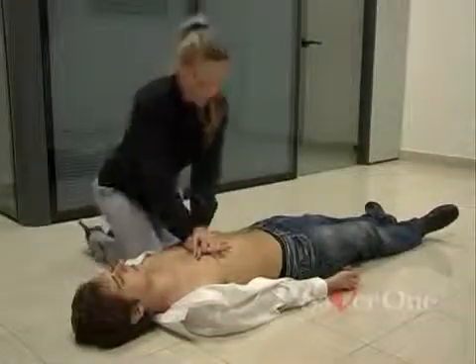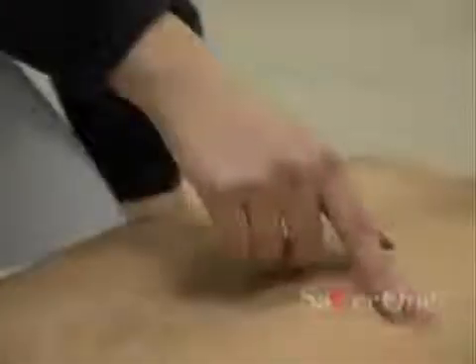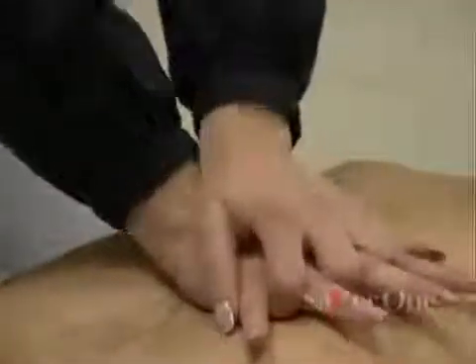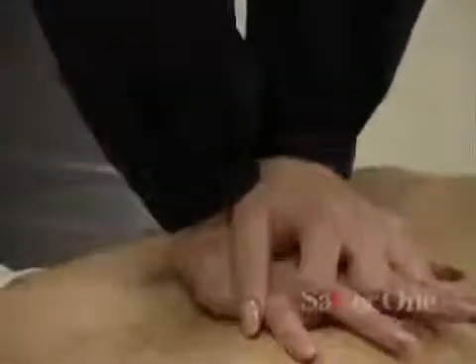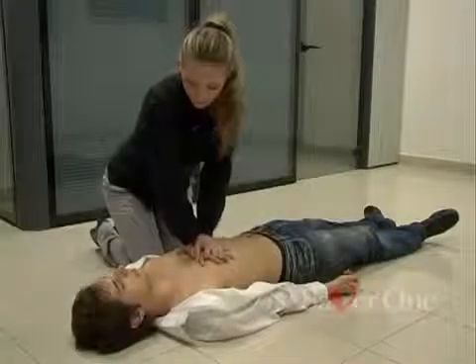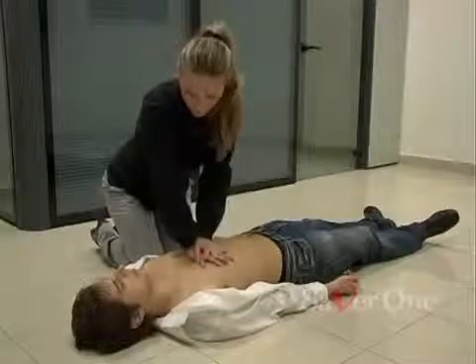First step: the heart massage. Place your hand one on top of the other with your fingers interlocked on the chest bone. Compress the chest 30 times.